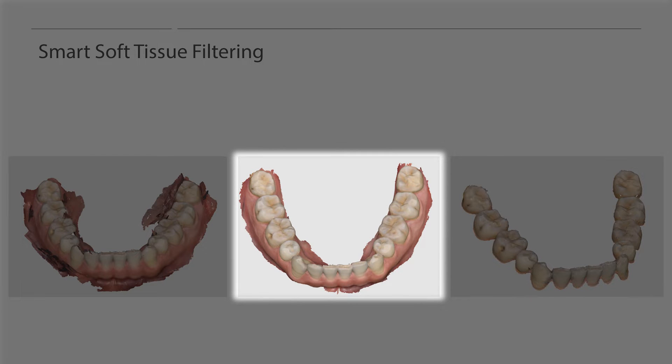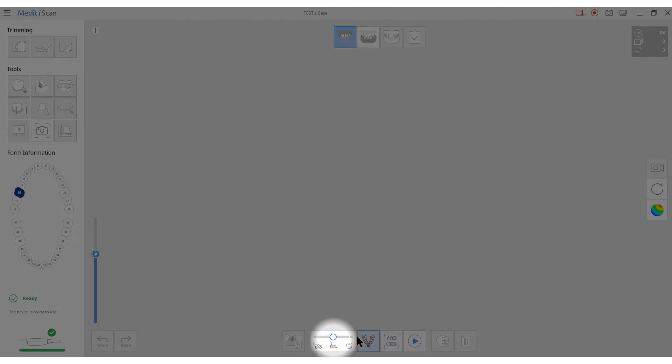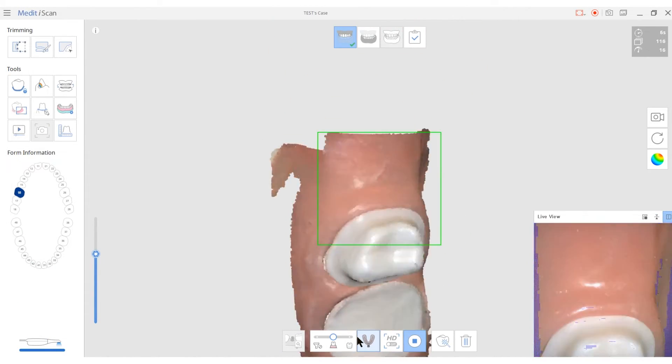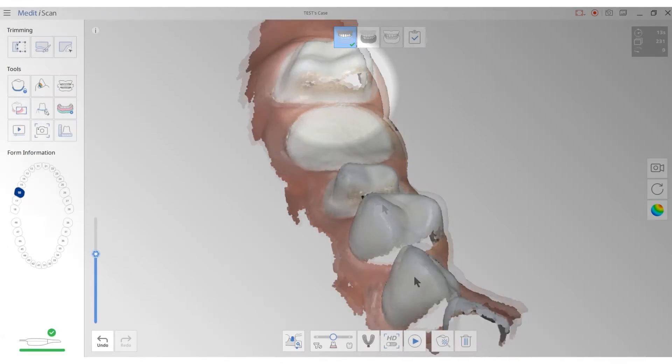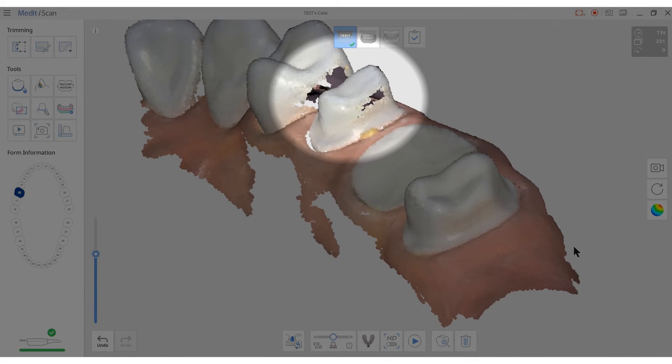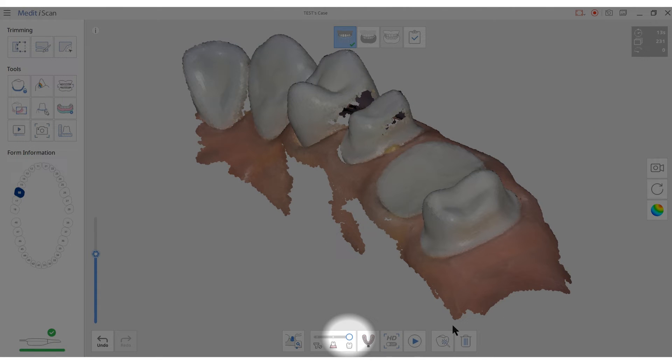The option in the middle allows users to capture only a certain amount of gingiva. This filter removes any soft tissue that interferes with the scan, leaving only the necessary gingiva. With this option, users can scan at a fair speed without soft tissue interruption, and it is suitable for most cases. The option on the right will block the gingiva and scan only the teeth surface area, which is useful when users need more data for the interproximal and contact areas. An ideal way to use this filter would be to scan the patient with the middle filter first, then switch to the last filter to capture additional scans of only the teeth.